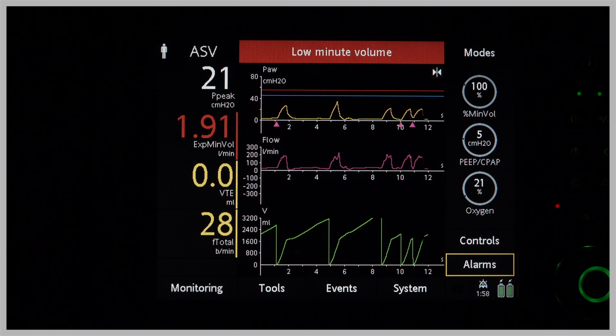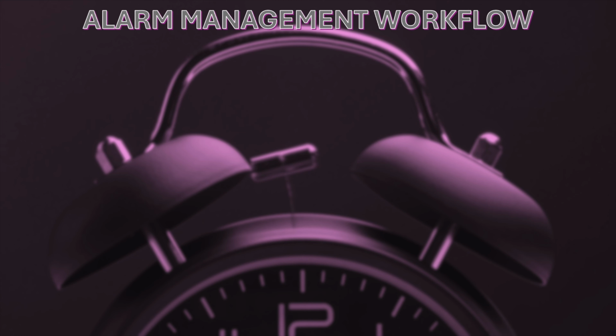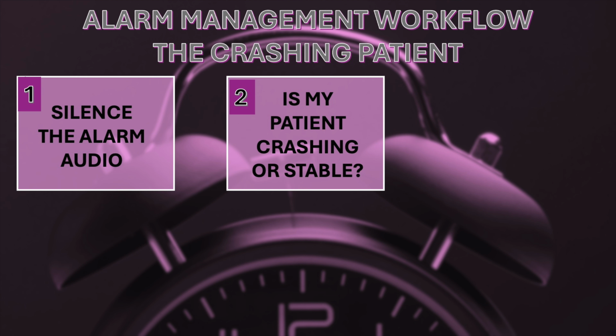Lights flash, alarm noises blare, and your head feels ready to explode. Oh my goodness, the horror! Step 1, silence the alarm audio. Step 2, ask yourself the most crucial question in alarm management. Is my patient crashing or stable?